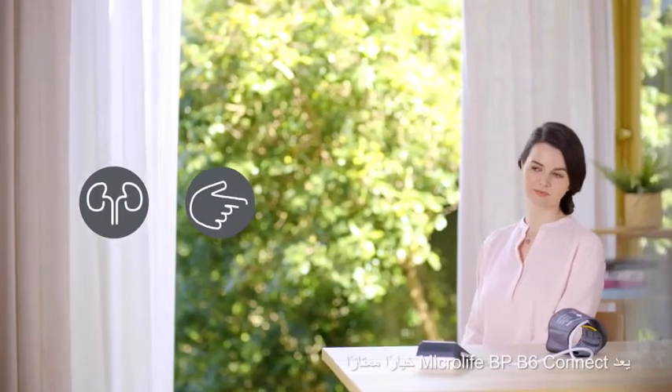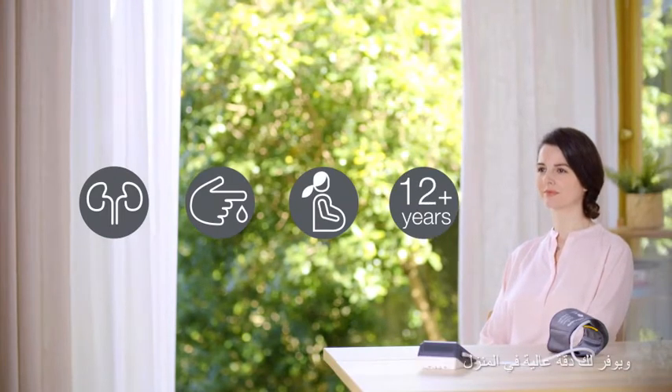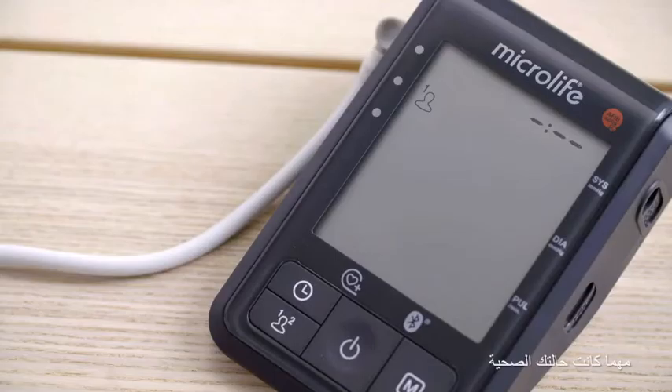The Microlife BP-B6 Connect is an excellent choice and provides you with high accuracy at home, whatever your health condition.